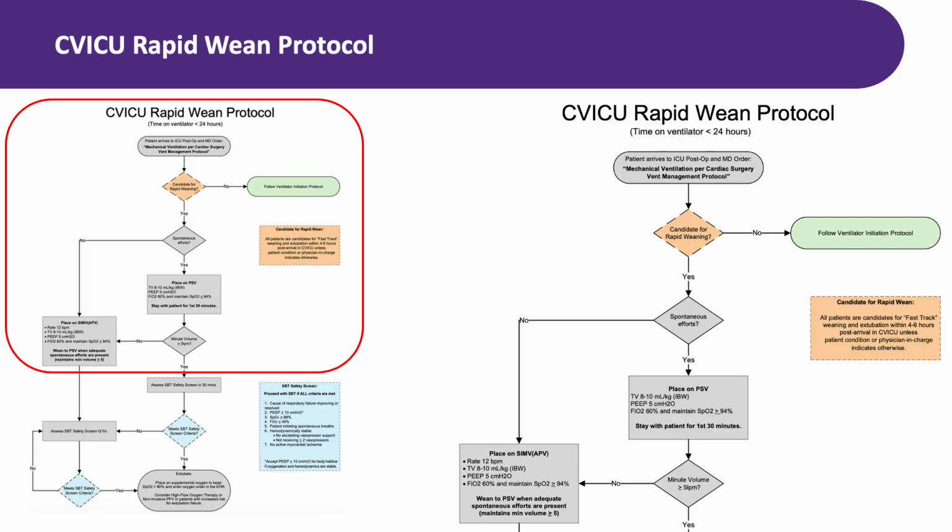Alright team, we're on our 5th and final protocol, the CVICU rapid wean. This is the cardiac surgery rapid wean protocol, and while it shares a lot of similarities to the post-op rapid wean we just covered, there are some important differences specific to the cardiac surgery population.